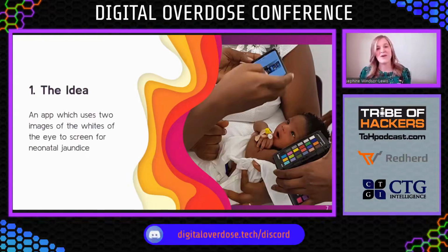Firstly, the smartphone cameras that we have now in modern smartphones. The sensitivity has just increased massively over recent years. And also the technology in the phone. We need a high level of processing power to be running this kind of analysis, and that has only recently become possible.